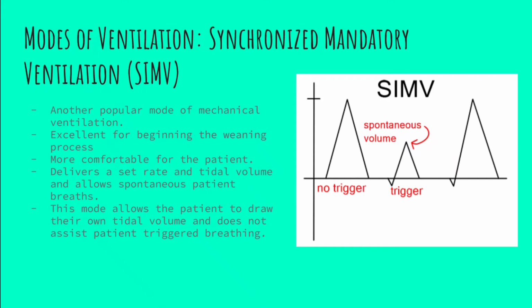So with synchronized mandatory ventilation, they often require much less sedation. Obviously, they don't require paralysis. If they were paralyzed, this wouldn't technically be SIMV because the ventilator would be functioning, in all essence, in a CMV mode of ventilation, because the patient's not initiating any breaths.